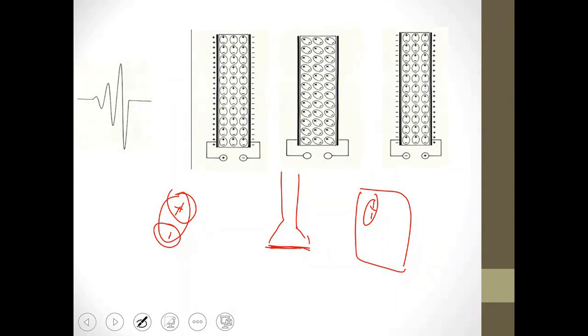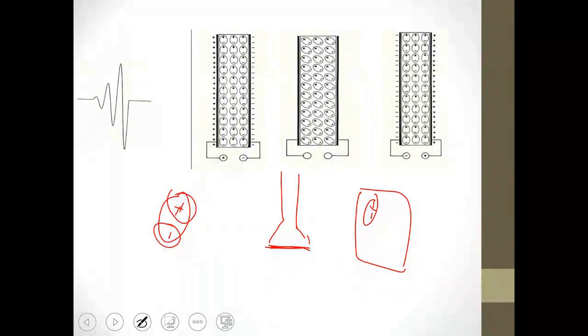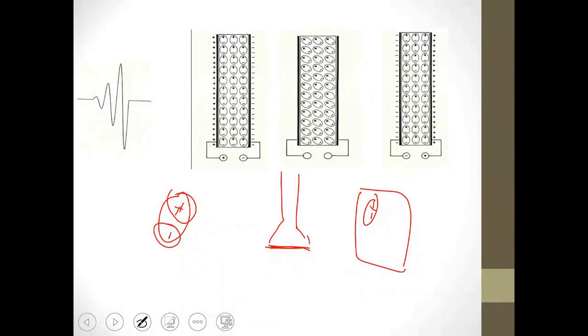In this case, what do I do? I take this device, or I bring the crystal with a certain structure that I created, with a specific orientation for the dipoles. I start to expose it to the electric field. As you can see here, this is negative and this is positive. So the molecules present will start to have a specific orientation, standing straight like this. Here is the negative electrode and here is the positive electrode.